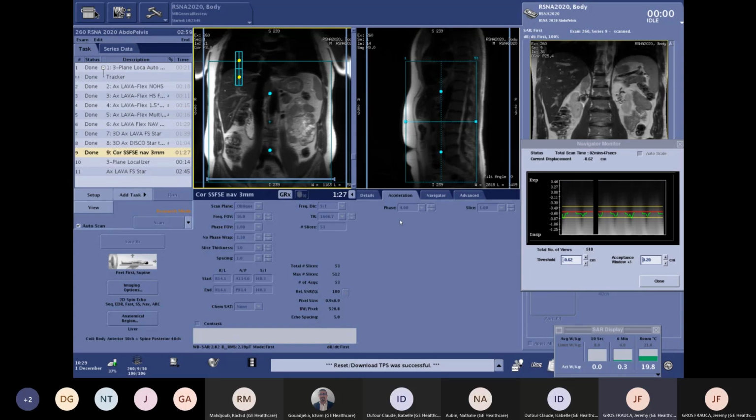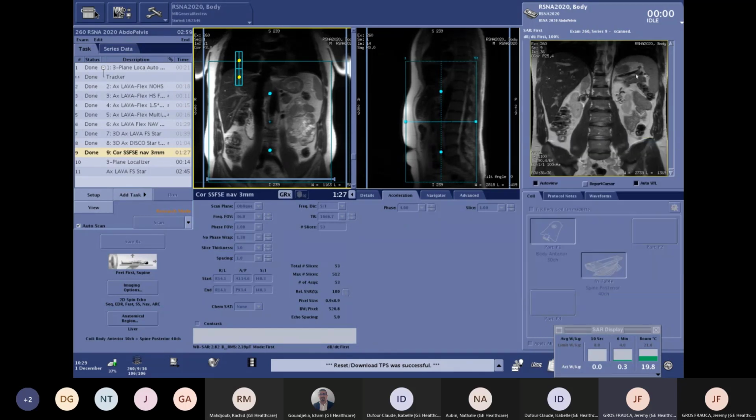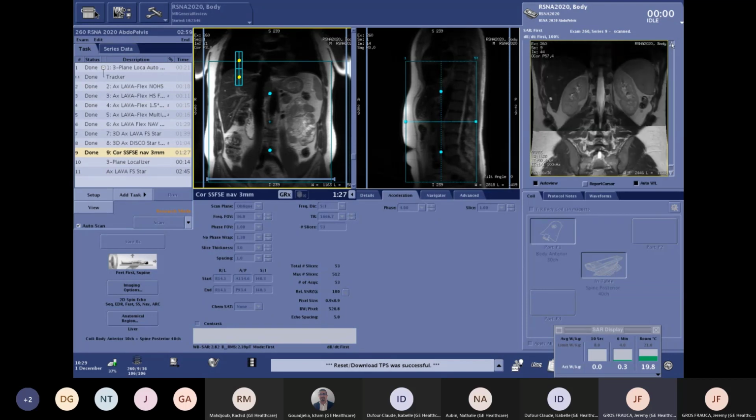I think it's important, Isabelle and Jeremy, to precise that this air coil with this new technology, very flexible, very light, it's very wonderful to manage the patient as well. I think it participates to the patient comfort and to the workflow. The technologists who have to carry a heavy coil all day long, it's very much a pain for them, and using this very light coil, it's a pleasure for them to use. And it's also possible to combine 2 coils as well.